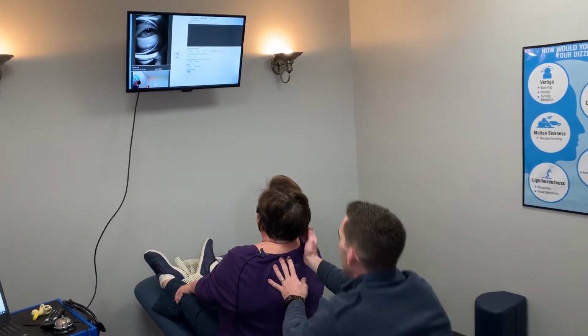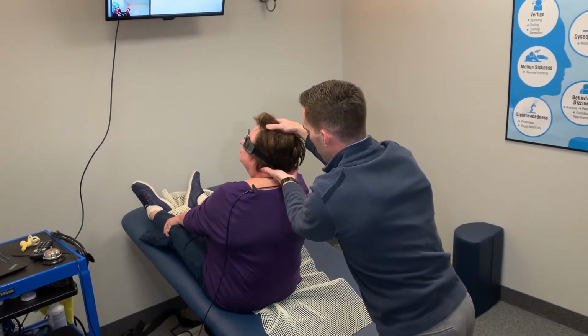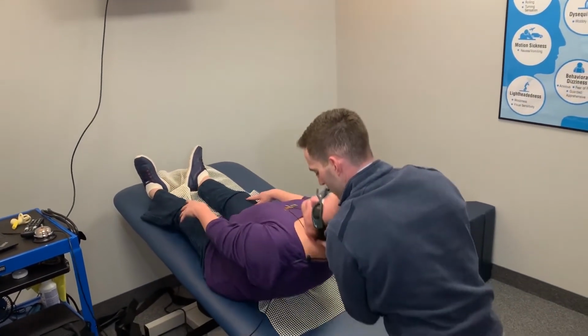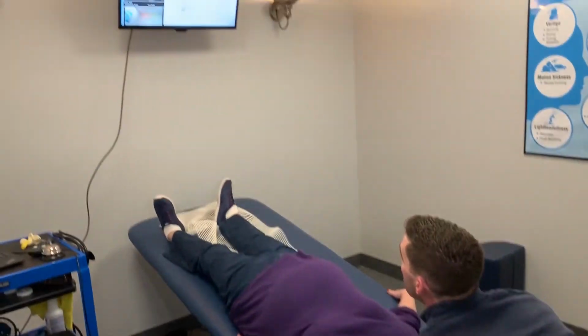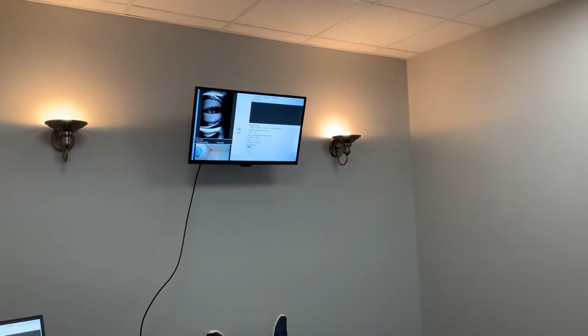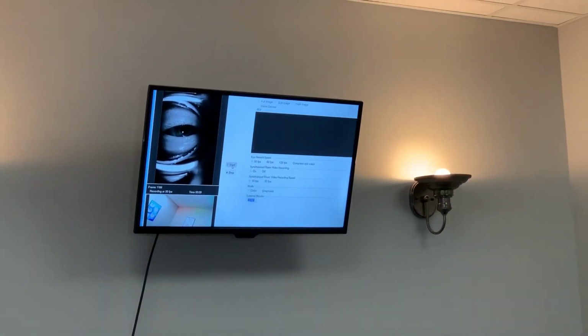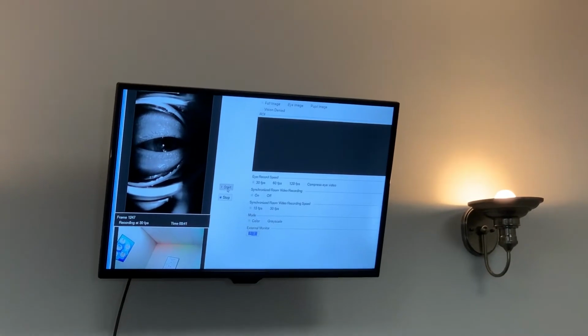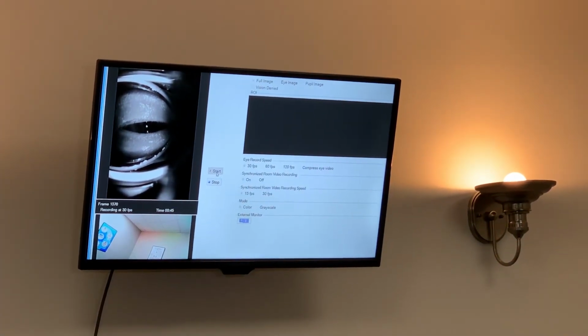And then we'll slip those goggles off and we'll go right into that maneuver to try and correct it, okay? So I'm going to turn your head to the left, and I'm going to have you come back towards me on the count of 3. 1, 2, 3. We'll probably see her eyes start to go up and down just like that, which shows us it's in the back canal on the left hand side. Dizzy at first, Pat, but now calming down. But it did calm pretty quickly.